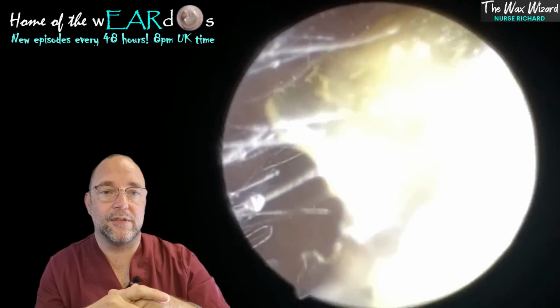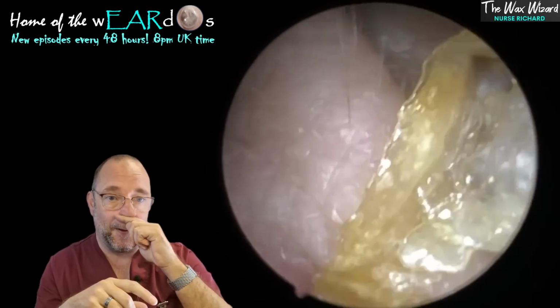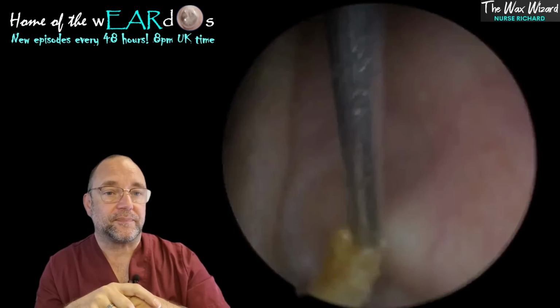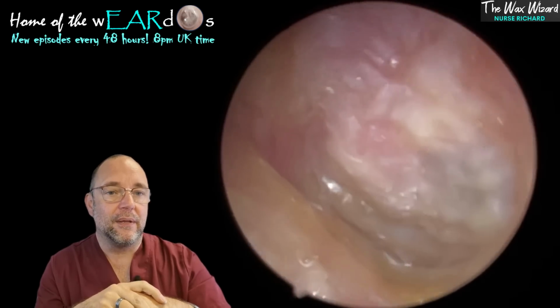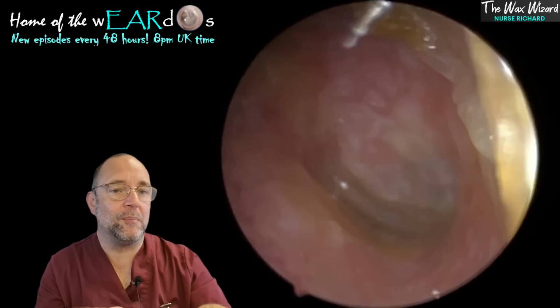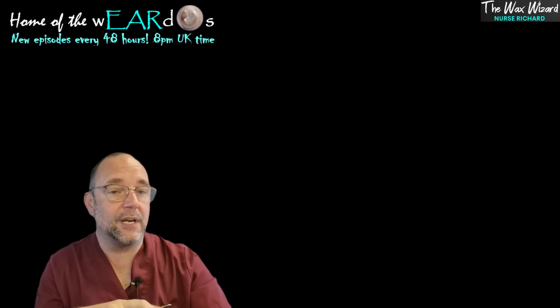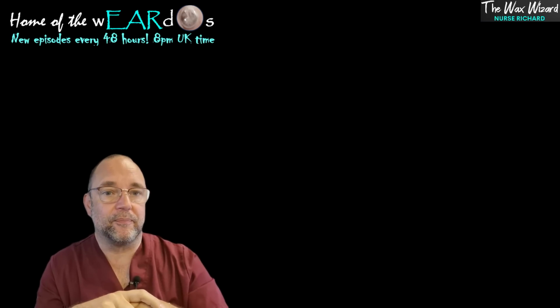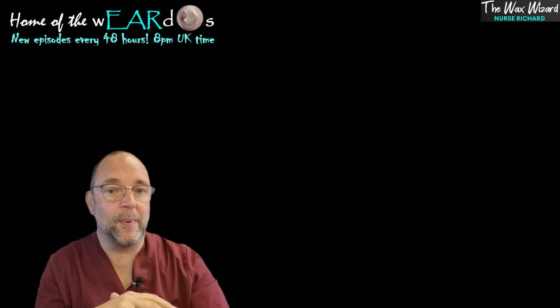But that came away so nicely, and it was after that bit that he could hear a lot better. It was instant, and it's left the eardrum still a little bit soggy. I'm not mauling around with that any more than I need to. A bit of oil down there, and I've decided to leave that there because I've told him he needs regular oil to maybe help encourage that skin to leave the ear anyway, and see if that buys him a bit more time.